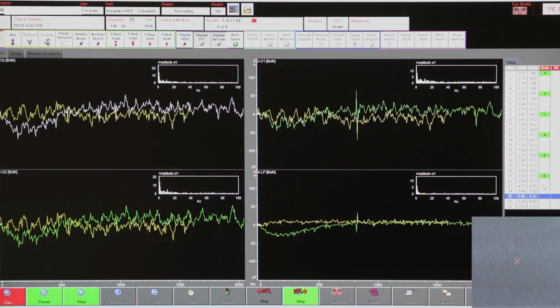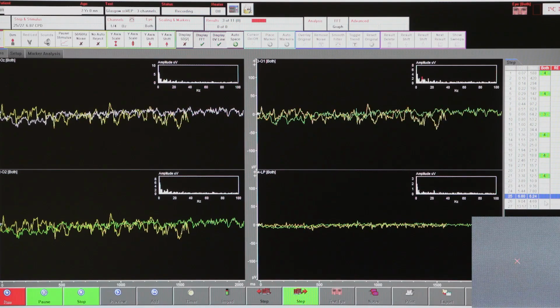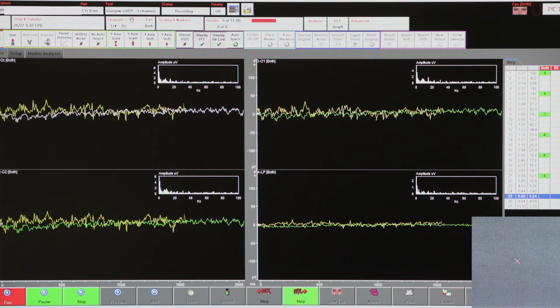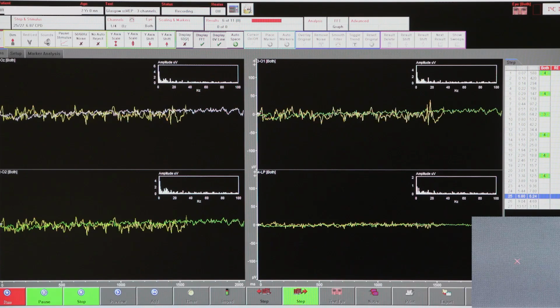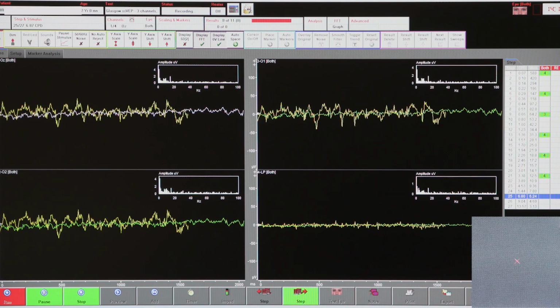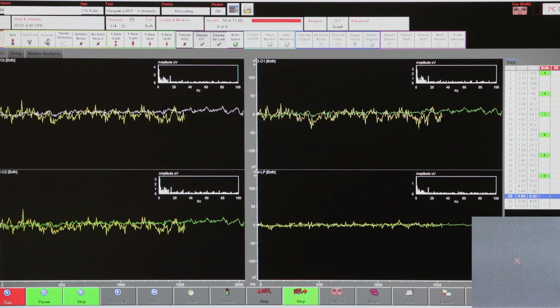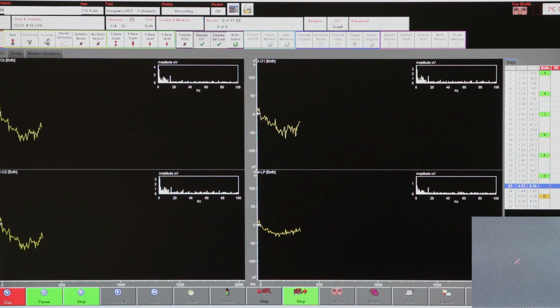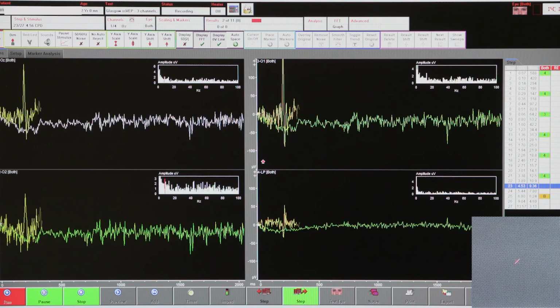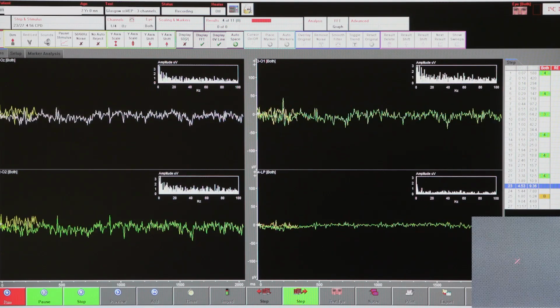So the test continues, stepping down in 4 here. And for each check size, we have a maximum of 11 epochs before the algorithm will give up and assume that no VEP is present. This is a configurable option, and it depends on the choice of epoch duration. Here, we're demonstrating epochs which are 2 seconds in duration and use a maximum of 11 epochs per check size.